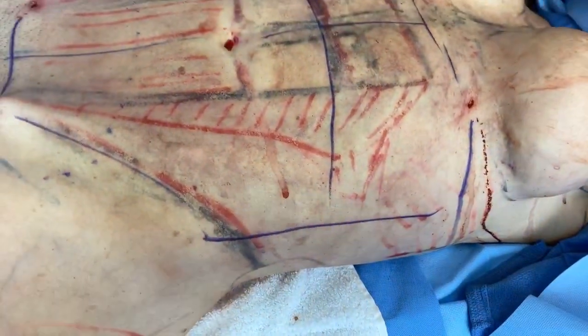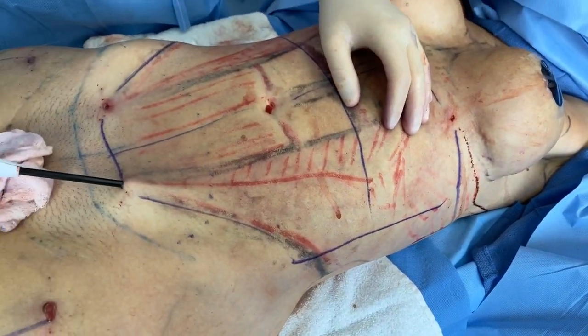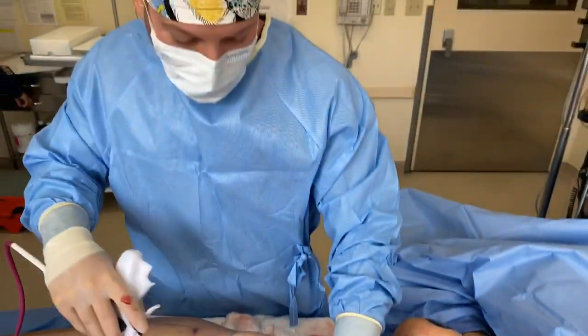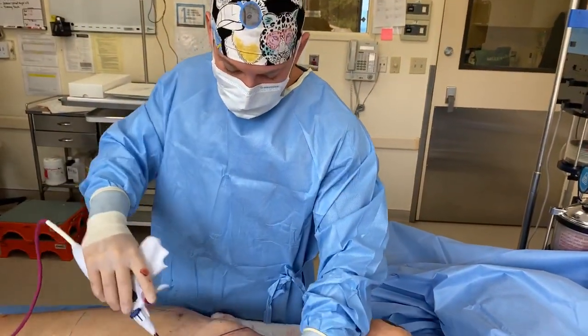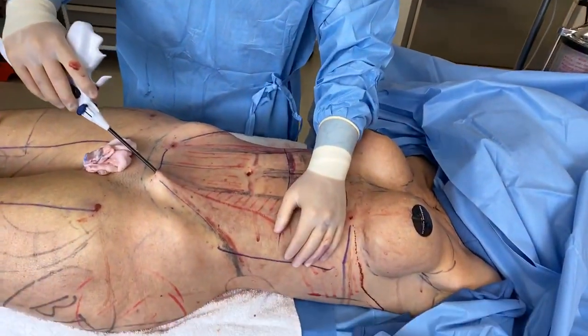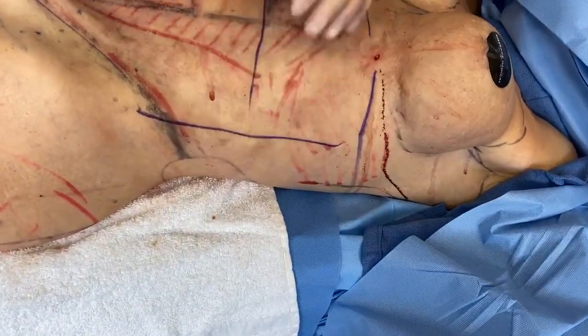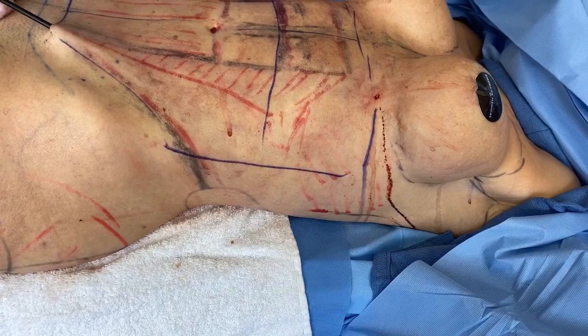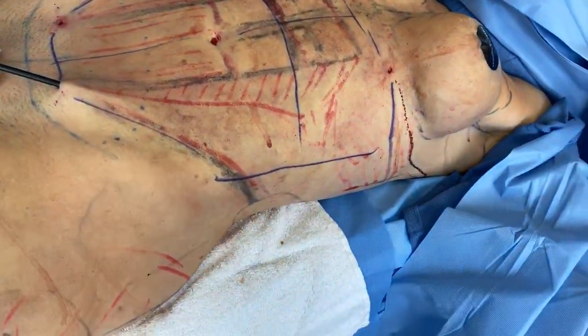Viewer asks: 'Is this the same device you were using for the neck?' Yes — the one we posted a few weeks ago, we also used on the neck in a smaller version. This is the body version. We're going to be doing one later today for the neck as well, but that's a different machine, a different device, a different company.